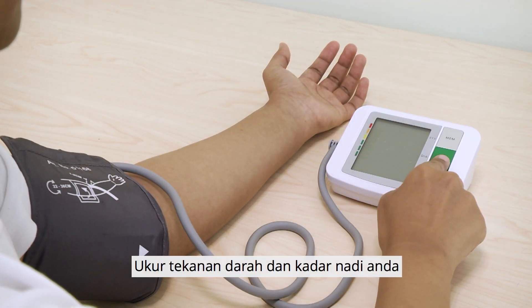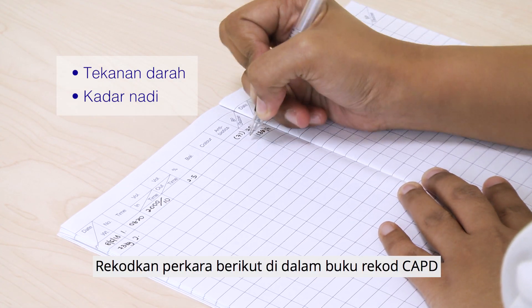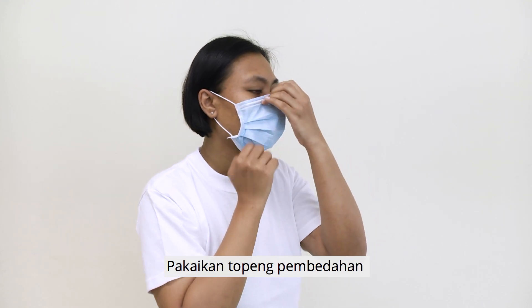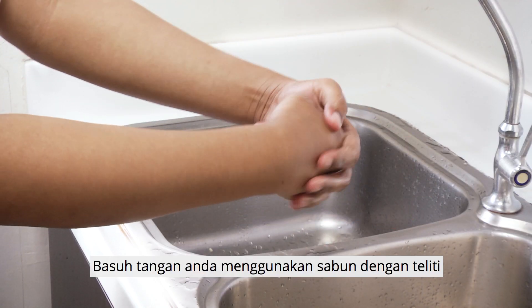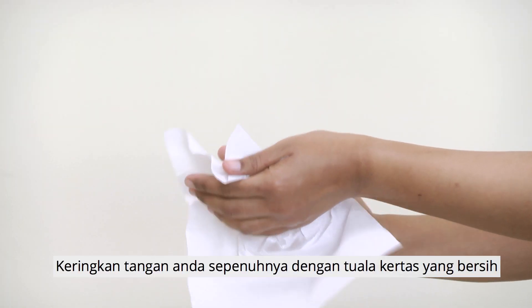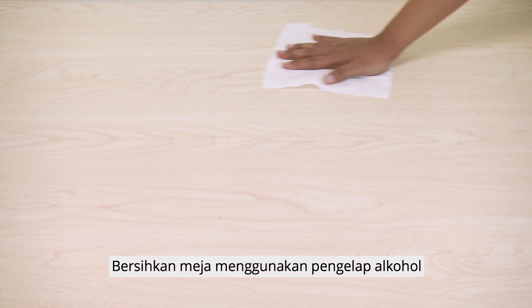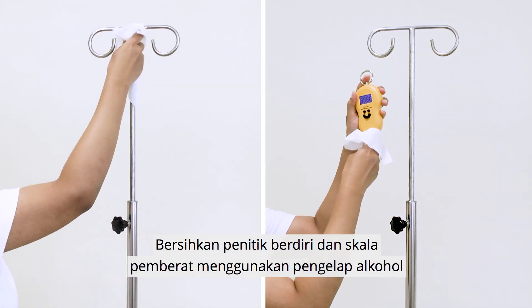Measure your blood pressure and pulse rate, and record them in the C.A.P.D. record book. Put on a surgical mask. Wash your hands thoroughly with soap, and dry your hands completely with a clean paper towel. Clean the table, drip stand, and weighing scale with an alcohol wipe.